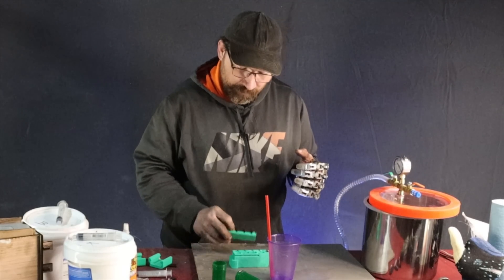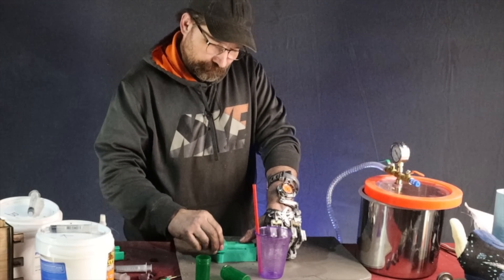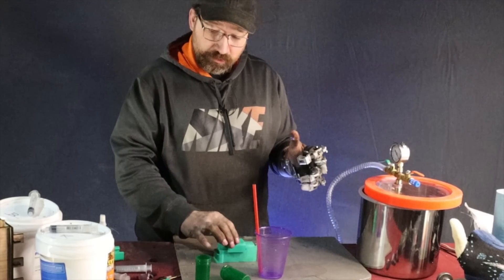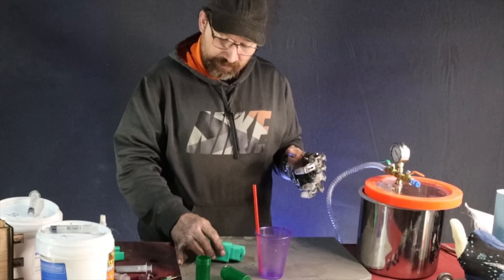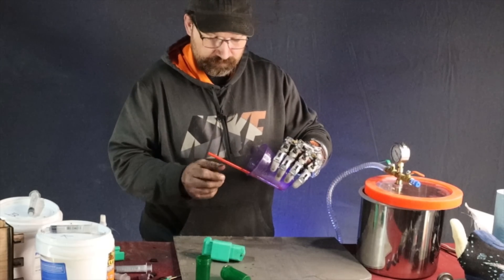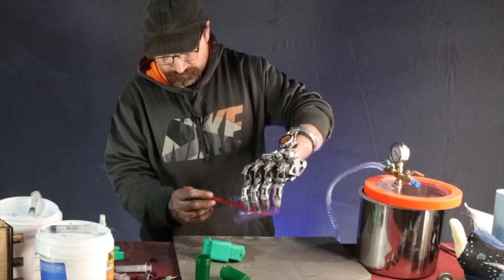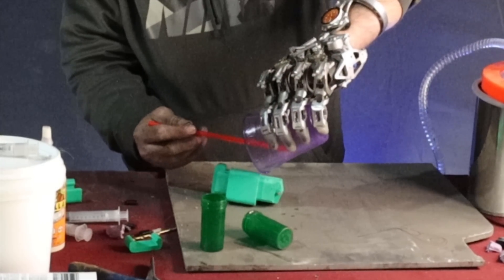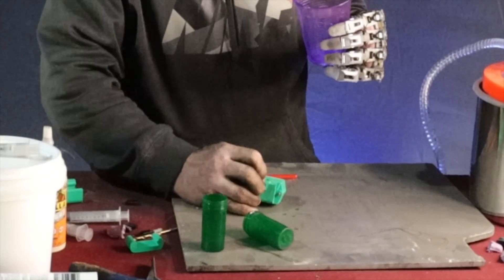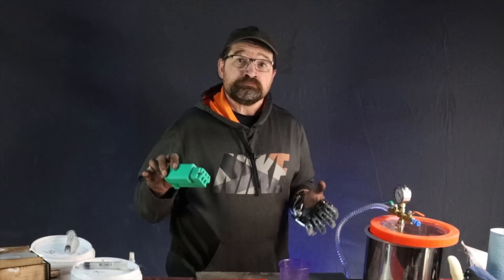Now that the molds are pretty full, go ahead and drop the caps on there and then put the top clamp on it. Next, I'll tip it at about 45 degrees and pour just a little bit down into the sprue holes just to make sure it's all the way full.